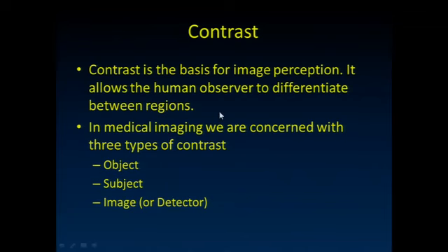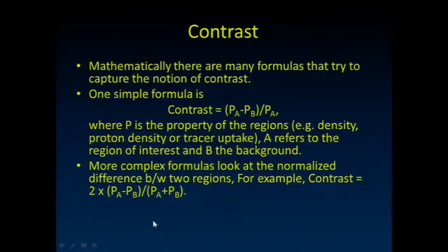It allows us to see on the film or the PACS two areas as being different in the image. In medical imaging, we're really concerned with three types: object contrast, subject contrast, and image or detector contrast, if you will. So what is contrast?